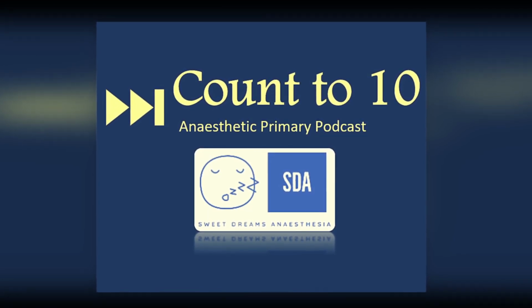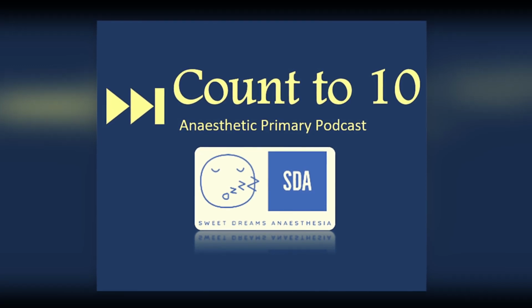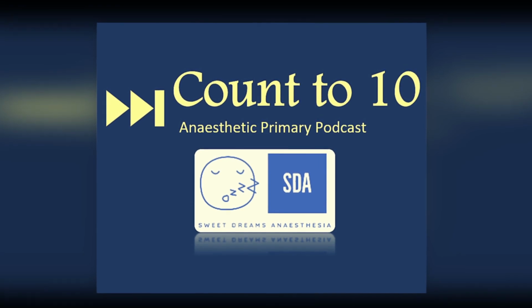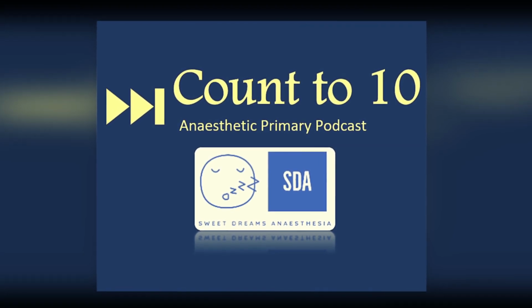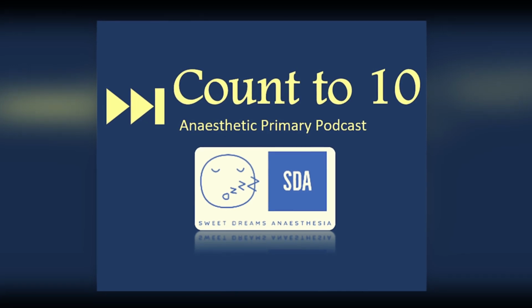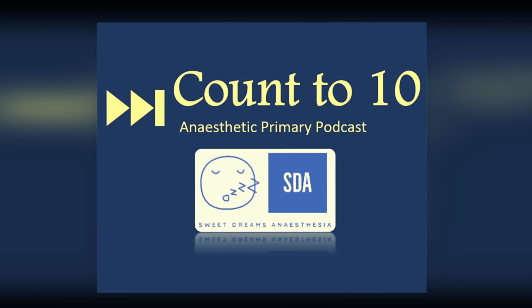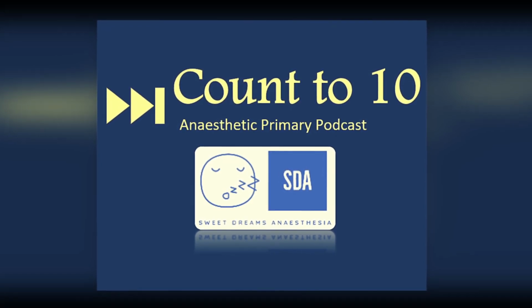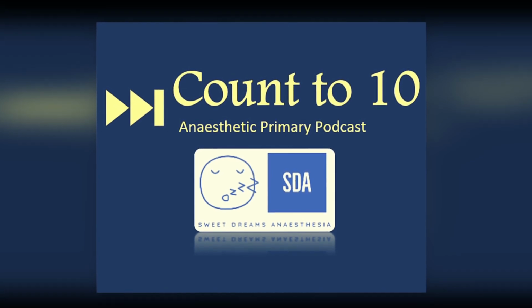To answer this question again, I would break it up into those three factors, which are the intrinsic limitations of the central processor, the errors at the probe level, and then the patient factors. And this is just taken from Propofol Dreams. And to me, this makes a lot of sense. Because if you imagine looking at the probe itself, you can think about what's happening at the monitor when you're seeing it, and then connecting everything down from the wiring to when you go to the patient probe interface, and then going to the patient factors as well. Visually, if you think of it this way, you won't miss a step.